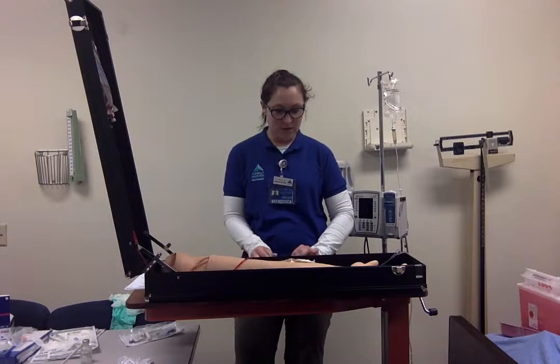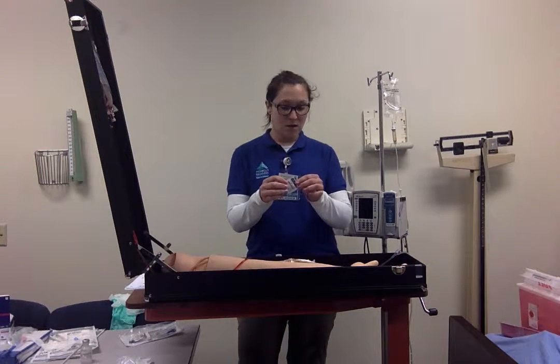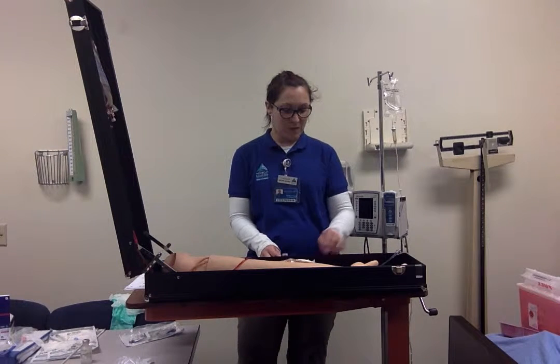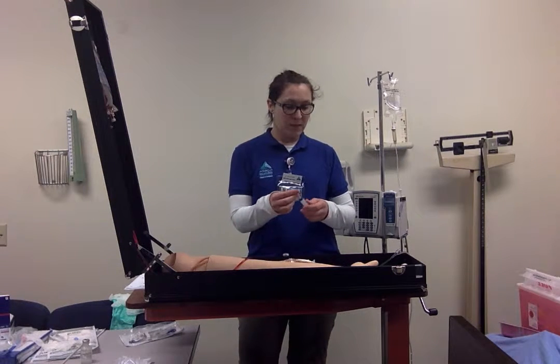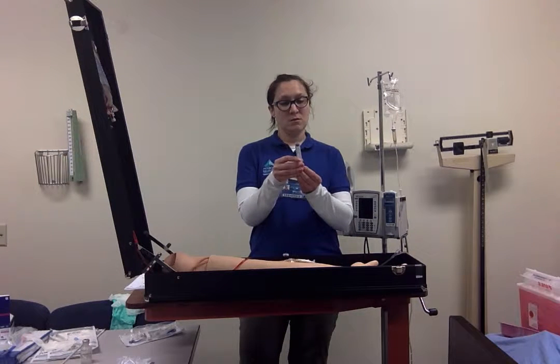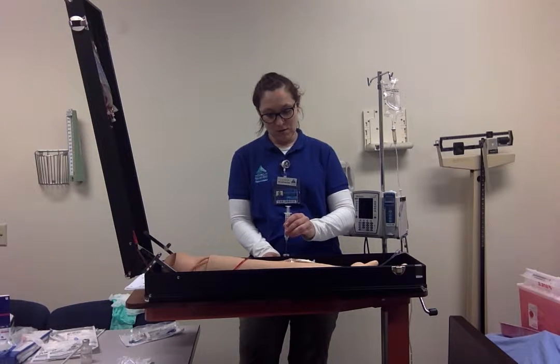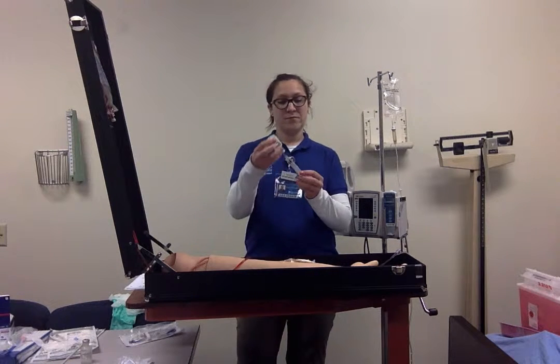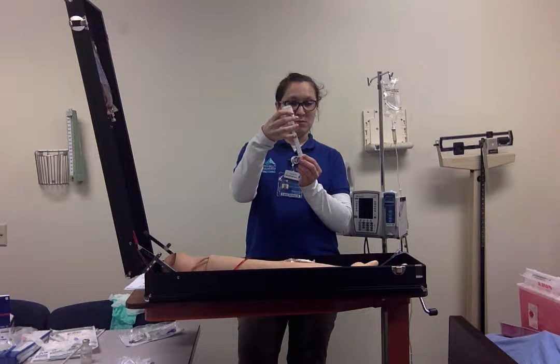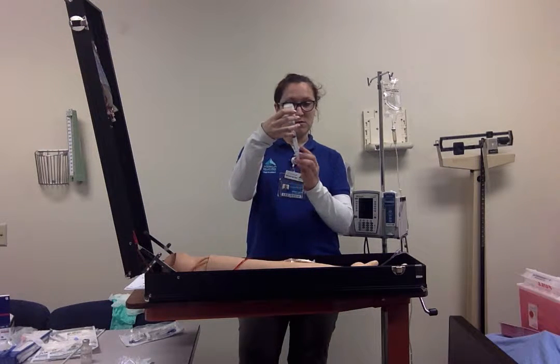So I'm going to be using aseptic technique, getting an alcohol swab, swabbing off the top, making sure that's clean. And I'm getting 2 milliliters of Rocephin. Drawing up 2 milliliters of air to inject, and drawing back 2 milliliters of Rocephin.